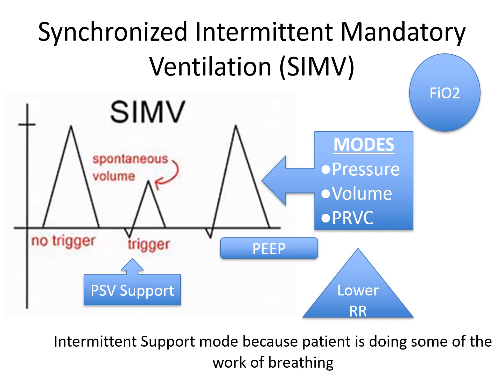So with that, when the patient does breathe on their own, it gives them a little bit of, we call it PSV support, pressure support ventilation. So this is important because when the patient does PRVC and they need a little bit of support when they're breathing on their own, we want them not to feel like they're trying to pull in so much air, like they're breathing through a straw. So this PSV will give them a little bit of support, almost like a blowing of air, so that they can inhale without so much effort.